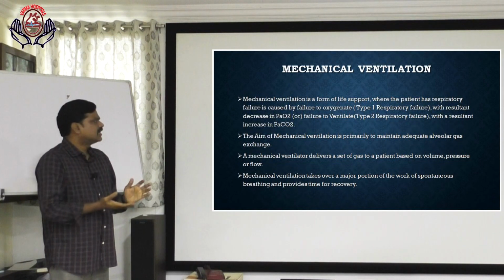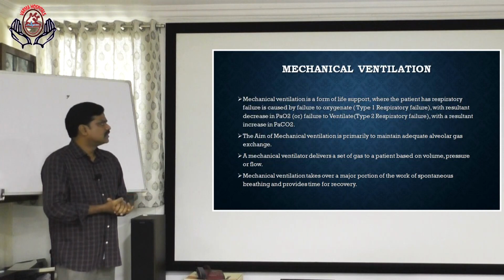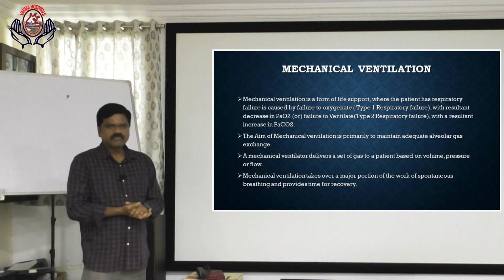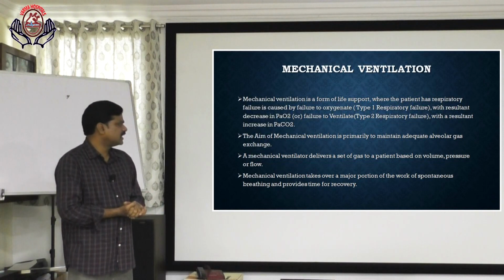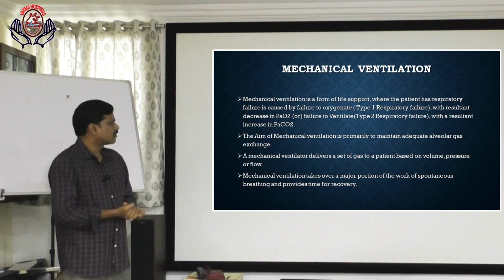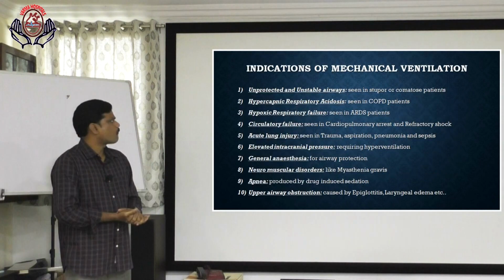A mechanical ventilator delivers a set of gas to a patient based on volume, pressure, or flow. Mechanical ventilation takes over a major portion of the work of spontaneous breathing and provides time for recovery.